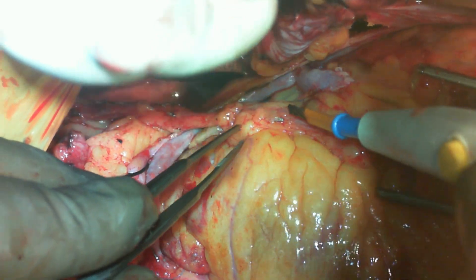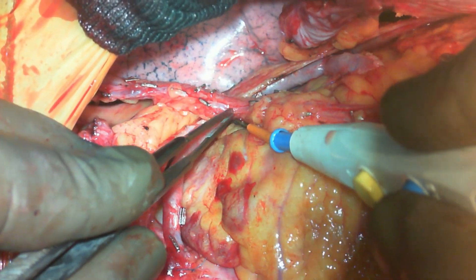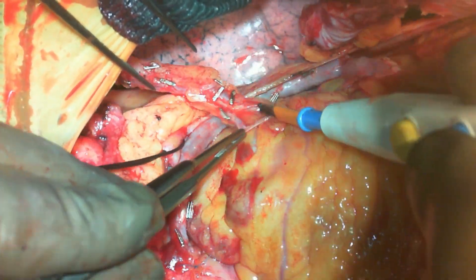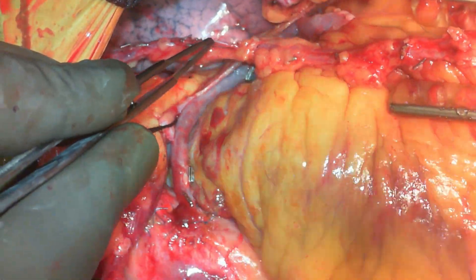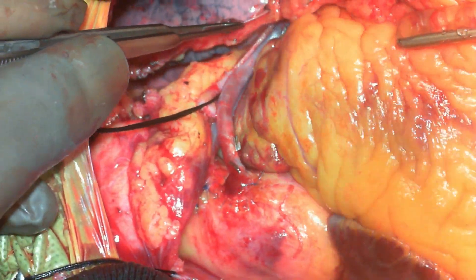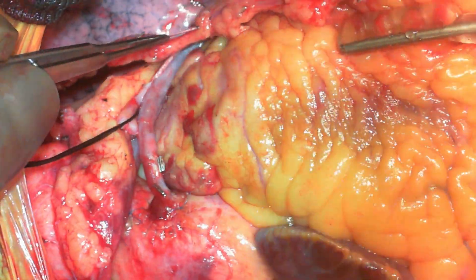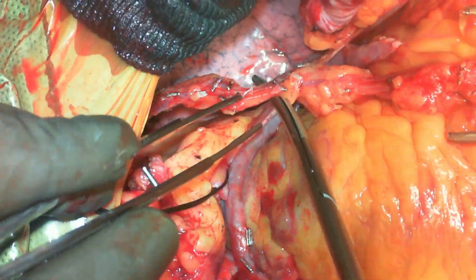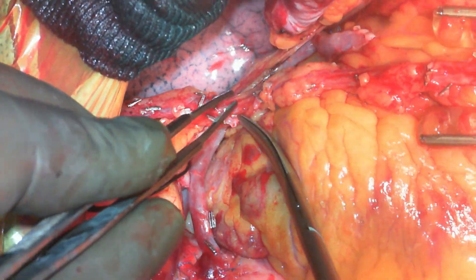The commonest way is to divide the veins accompanying the IMA — we do it before grafting, and only in some cases after grafting. The vein accompanying the IMA can be divided from the distal end to the top end, along with dividing the fascia posteriorly. This will definitely add to the lengthening of the mammary. Doing it before grafting is more useful than doing it after.